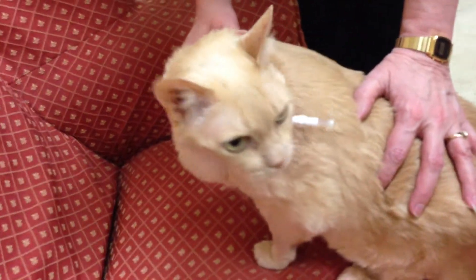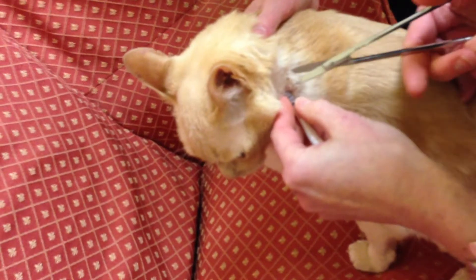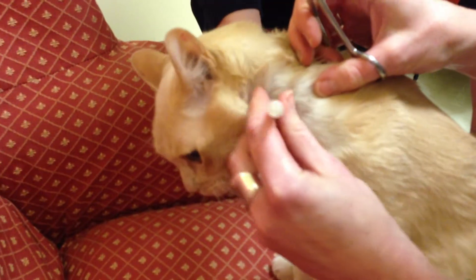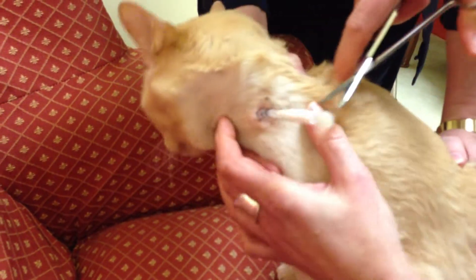We'll just have to take the suture out. You're being very, very good, I know. Almost there. I know, buddy.